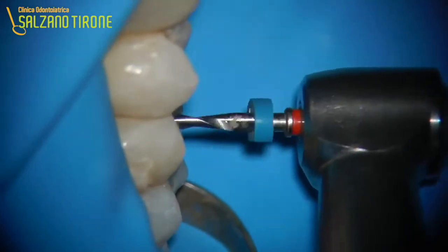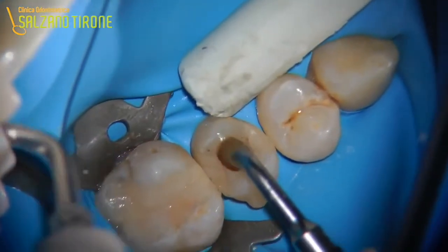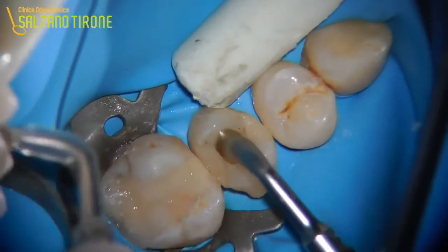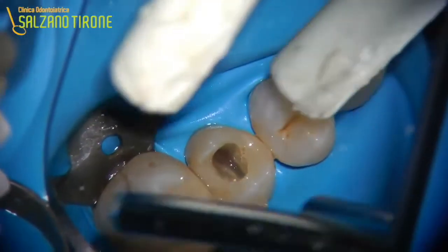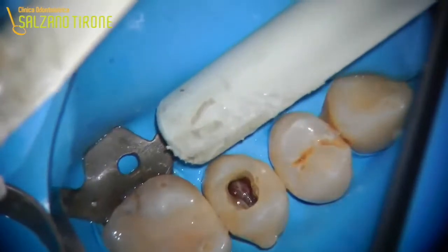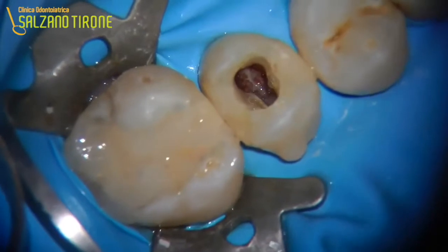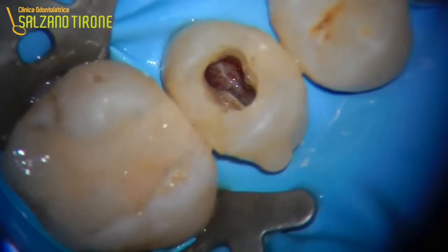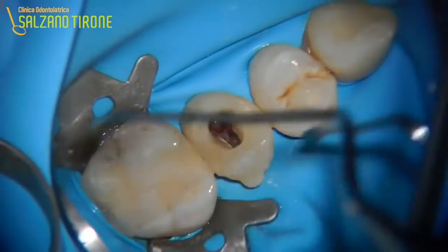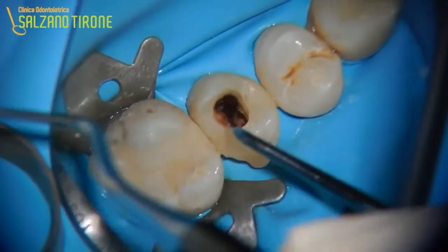Once molded the root canals, after excluding that the bleeding we will later observe in the external resorption is of nervous nature, we can then start widening the access cavity towards the defect. Since we know it's located around the palate, we need more visibility in that area, so we slightly modify the access cavity. As you can see in this video, we use a StartX 1 to widen the opening slightly. You can also do it with a bar. You do this to have a better visibility.